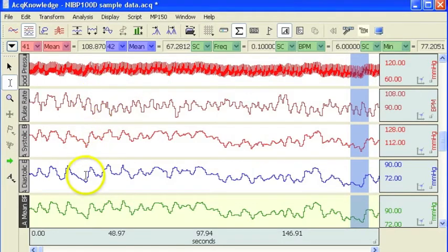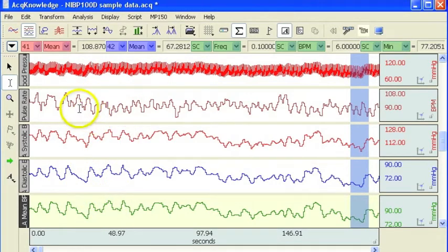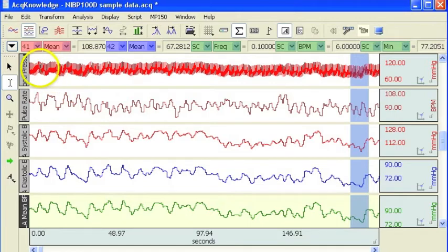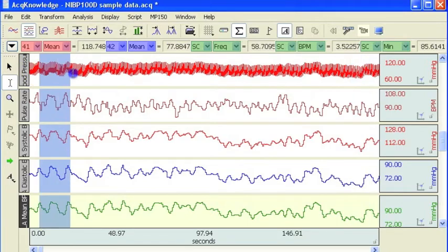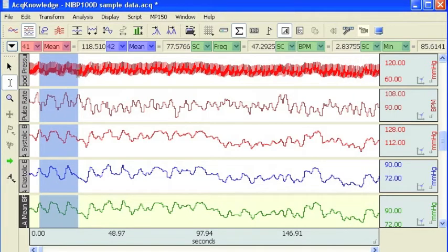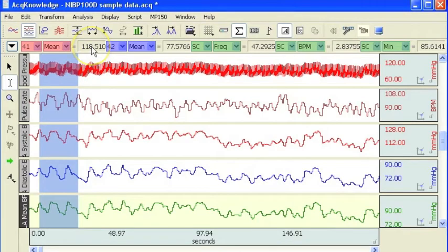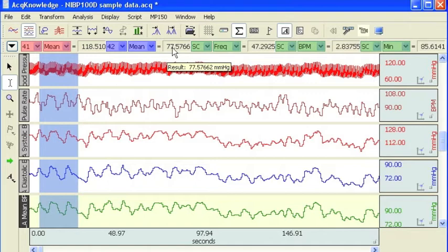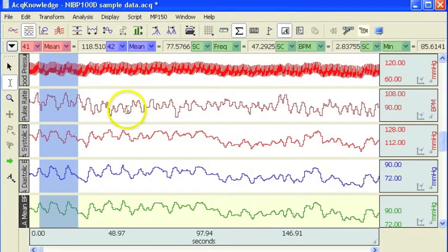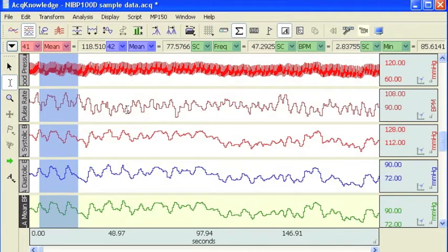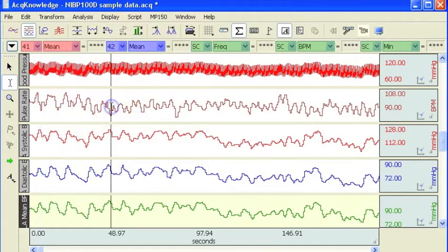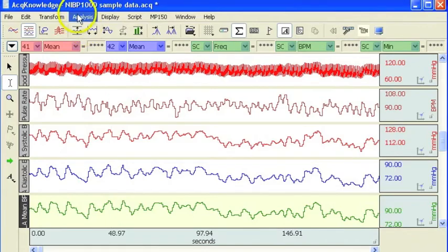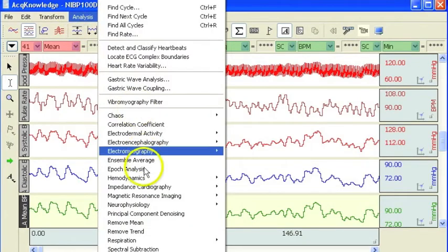In the sample file that I have got open here we have got a blood pressure waveform with heart rate, systolic, diastolic, and mean pressure measurements. In this case quite often you are going to take different measurements from different channels. You come in, you highlight an area of data, and the measurement results are updated, and you can paste those down into the journal file or into Excel. It is also possible to automate this procedure by using the fine cycle peak detector, but there is a nice tool located in the analysis menu.